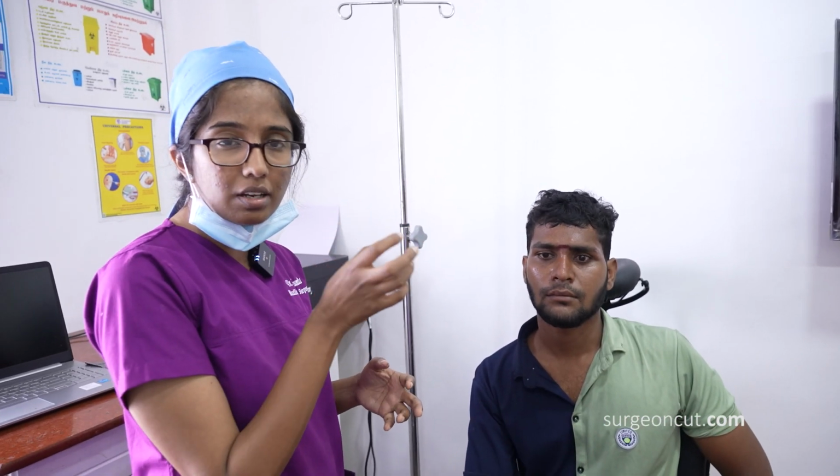Okay. So he has something called enophthalmos, where one eye is gone in, it's sunken inside. So we need to do enophthalmos correction for him. Plan to place an orbital mesh.